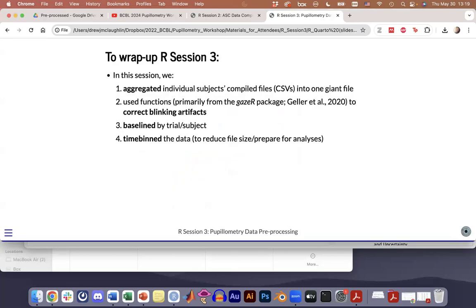To wrap up, so that we can go enjoy a lovely lunch together. This is the real meat and potatoes pre-processing. You are all troopers this morning for turning iLinks files into something intuitive. That part is sort of a thankless process. This part, we've actually taken our data and done really cool stuff. We've cleaned it up. So what did we do?